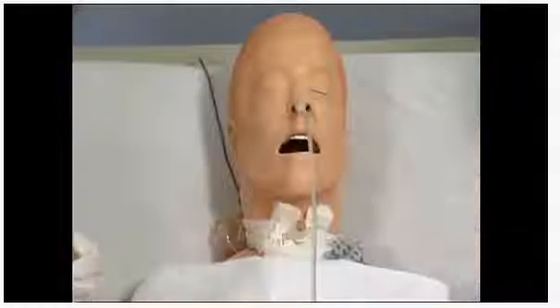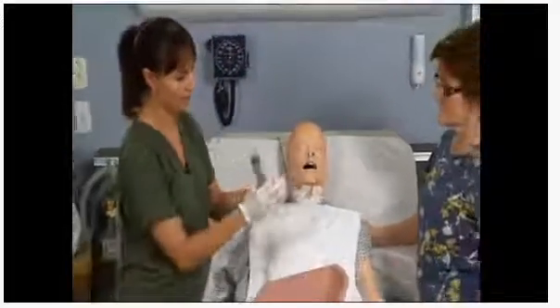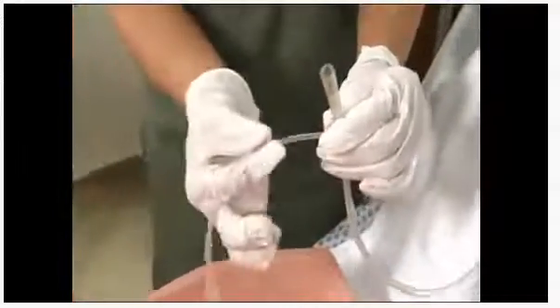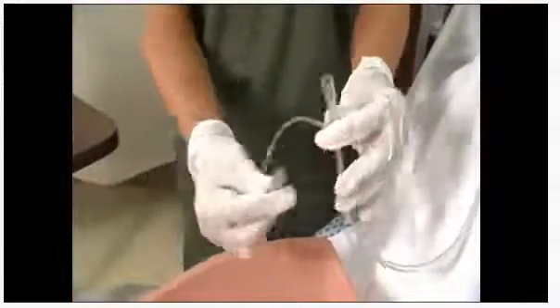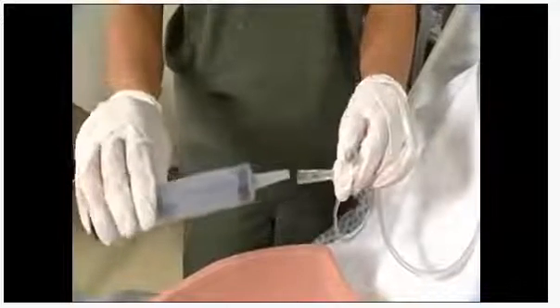Okay, so the next thing that I'm going to go ahead and do is verify for placement. With my irrigation kit, I want to attach it to the very end. And when you look at these NG tubes, you will notice that a lot of them will have pigtails. Do not use the pigtail. This is used as a vent. So you want to make sure that you attach it to the very end.